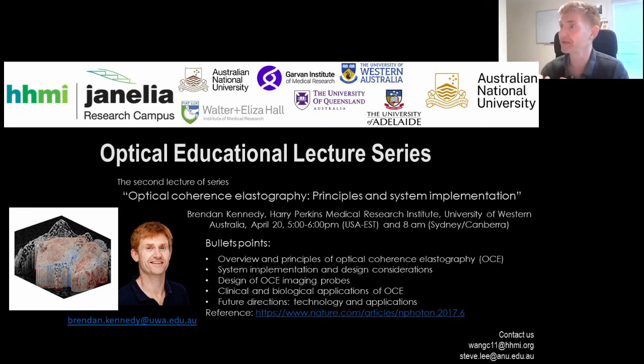We've just published another paper where we're looking at speckle, and at the inaccuracy of phase sensitive detection brought about by dark speckle itself. I don't know if people are familiar with speckle reduction. In OCT, there are techniques where you gather a number of images, each with a different realization of speckle, and incoherently average them together to increase the image contrast.